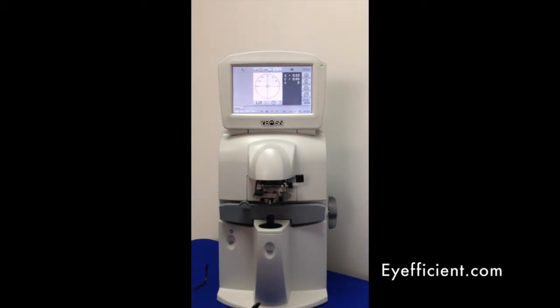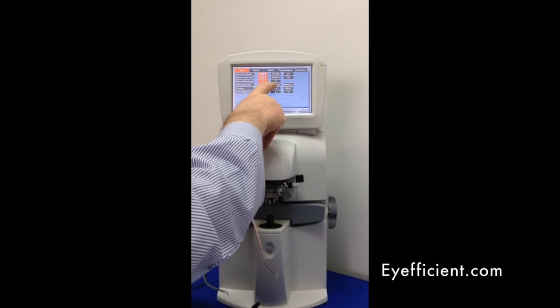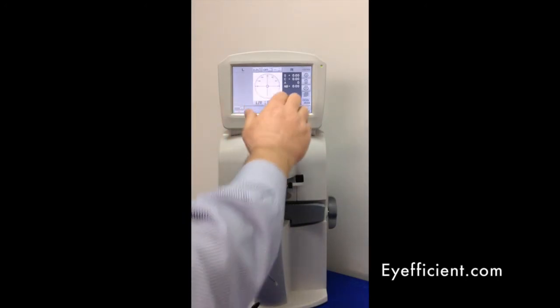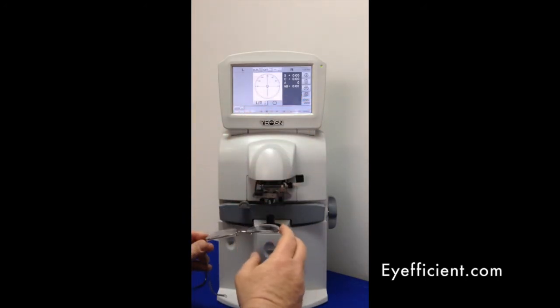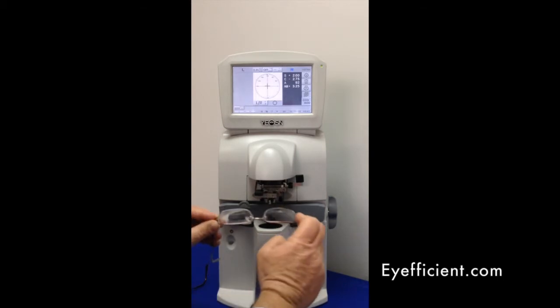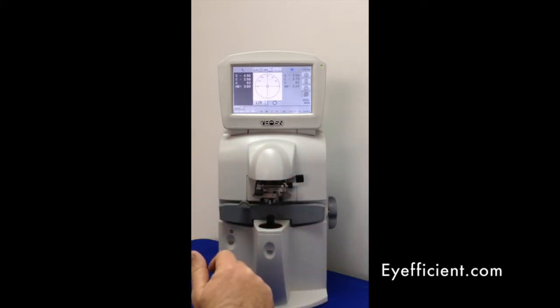For a bifocal lens, go into the settings menu, select bifocal under multifocal lens, and hit OK. You're now in bifocal mode in manual, so you'll use the button to grab each measurement. Go to the distance, find your optical center, hit the button, then go down to your add and hit the button to memorize that. Move to the other eye, find the optical center, go to the add, and memorize that. That's how you measure the bifocal.